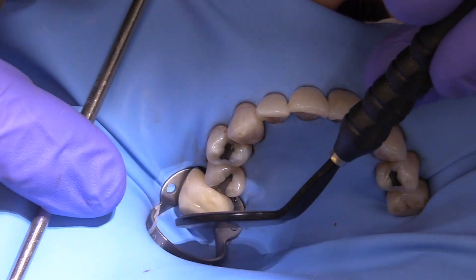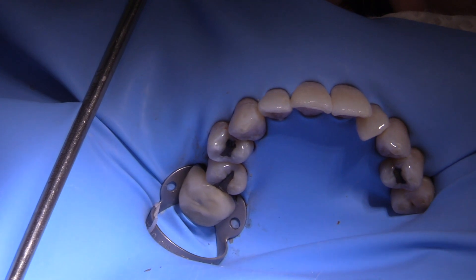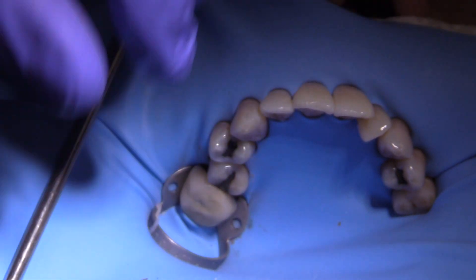It's always good to set the stage for a nice procedure by really spending the appropriate amount of time on the rubber dam placement.